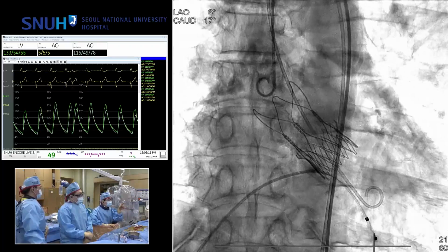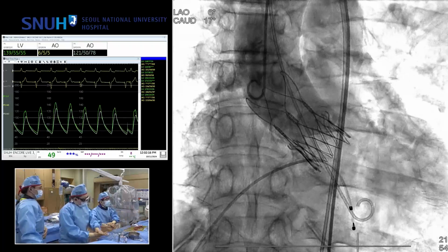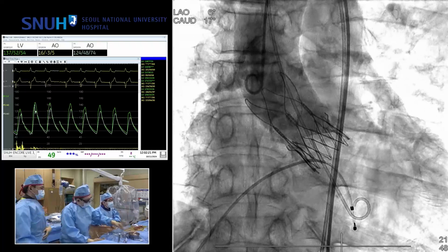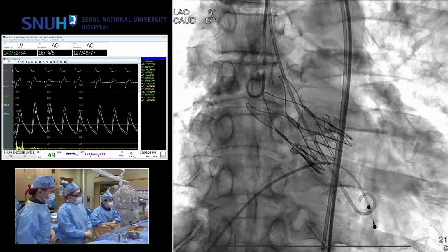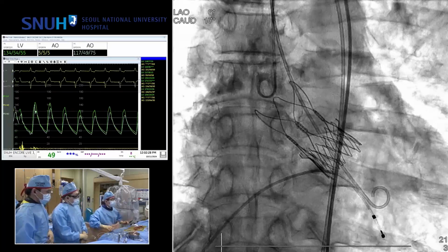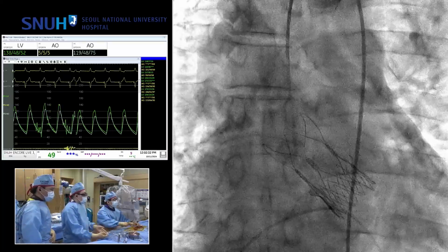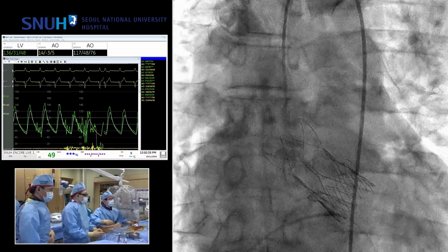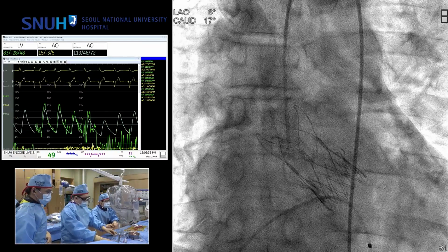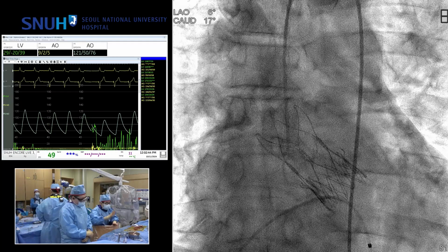Then at the final 15 or 10 minutes, after you go to the Yamamoto and return, I will show you the angiogram. Considering the patient age, your procedure is successfully done and wonderful cases, and congratulations. Do you want to see me engage the coronary artery? No, later. Later, okay. Thank you.